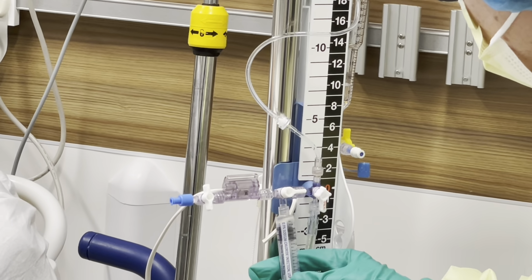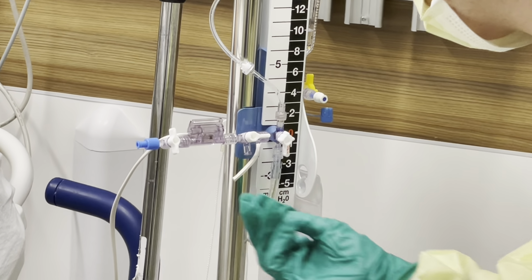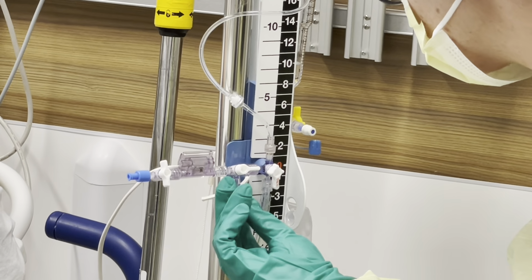And what you will end up doing is you can twist this off, okay? This is garbage. This is, again, not going to be hanging down like that. It's going to be in the back. You're going to put this down like that, okay? So now you're good. You would again grab your next buddy, because you're still sterile, and when you zero it, you should still be sterile. But for the sake of everything, we will have our buddy come in. They will hook up our transducer, because again, they're going to be clean, not sterile. Okay?